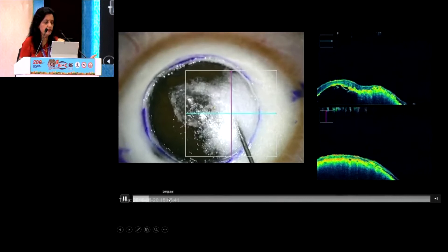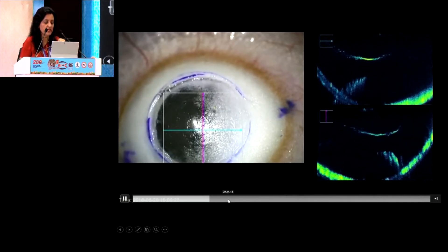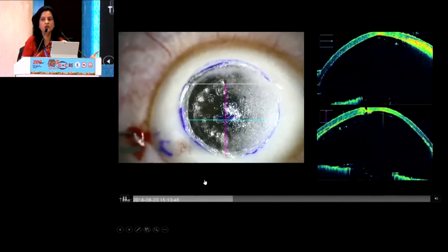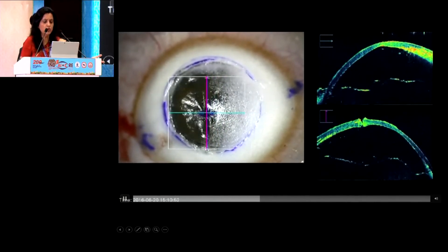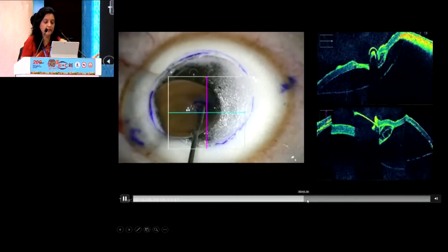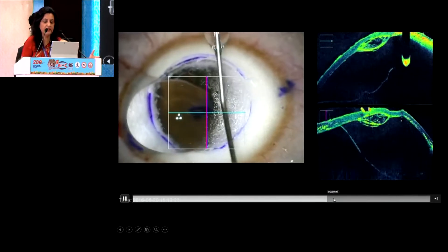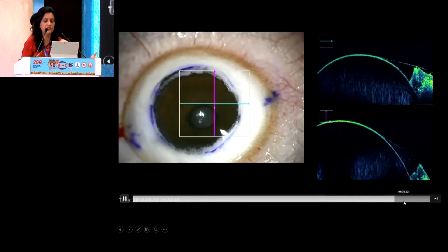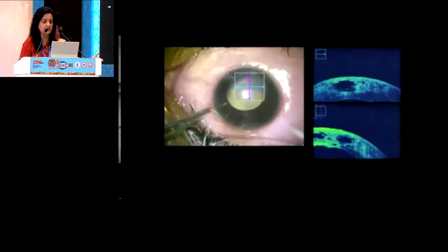The classical technique of big bubble DALK — we used to imagine earlier where our big bubble is and where the air has gone. But when you give the nick of the overlying stromal layers, just look at the way, like a live show, the Descemet's membrane obliges you and marches towards the overlying stromal layers. You know exactly that your air bubble is coming out, the Descemet's membrane is marching over there, and you are in the correct place. When you push viscoelastic there, just like a kangaroo's pouch, it inflates again and you know you are at the correct plane. The overlying stromal layers can then be excised. This is a bare Descemet's membrane — you are extraocular, you have not entered the eye, and yet you have done a corneal transplantation procedure and given vision to the patient.